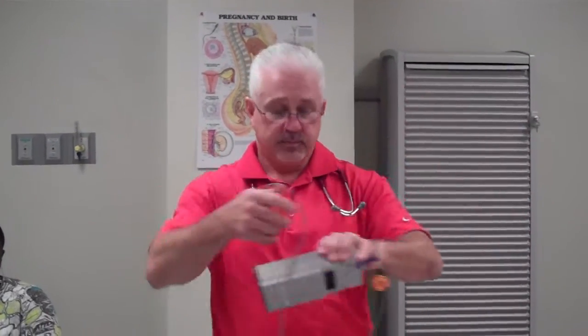I need to have my medication, which I would get from a Pyxis. At most hospitals, that's where the medication is being stored. And I will also have a pulse oximeter, my stethoscope, and I also would have my watch on, which I do not have on right now, but need to imagine that I do. And I'd have a watch on so I can take the patient's vital signs.